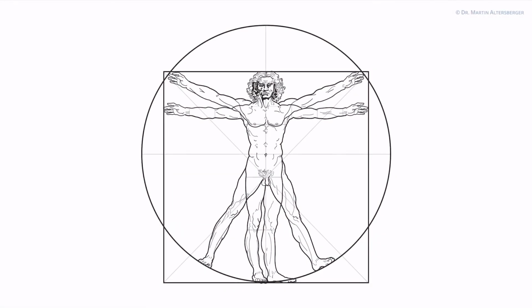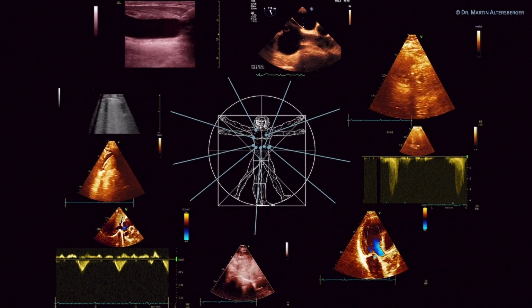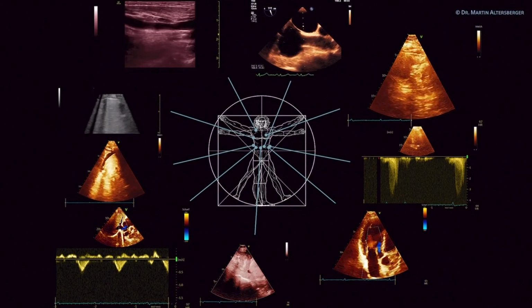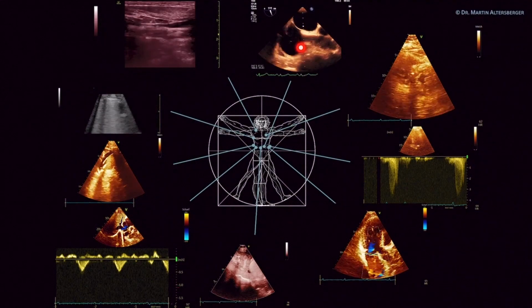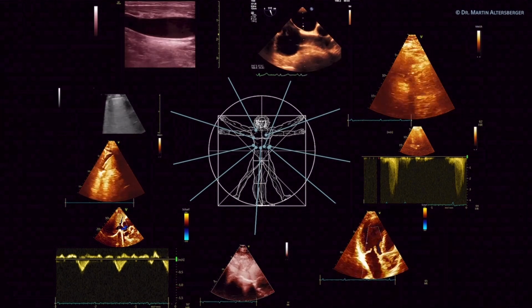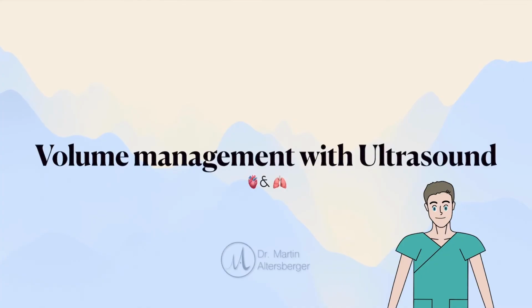What is the volume status of this patient? That is a very complicated question where ultrasound can actually help you answer very often. Fortunately, we can use several loops, videos, images, and imaging modalities. Here, for example, ultrasound of the jugular vein, TEE studies, TTE studies, Doppler studies, and many, many more to figure out what the volume status of our patient actually is.